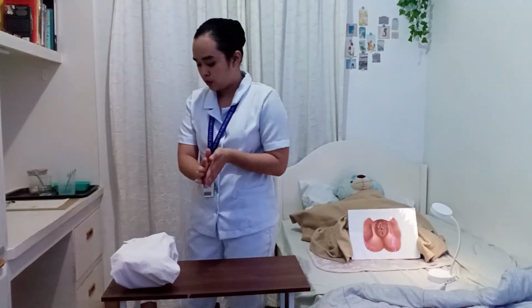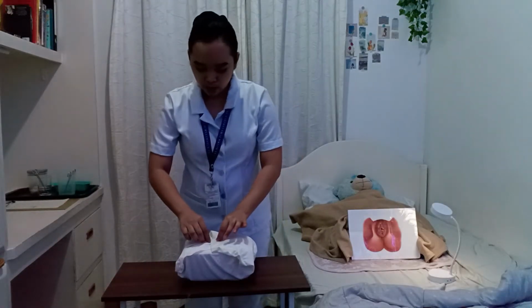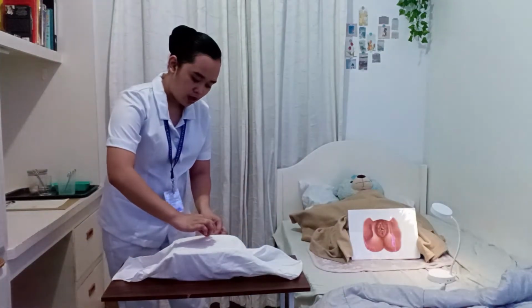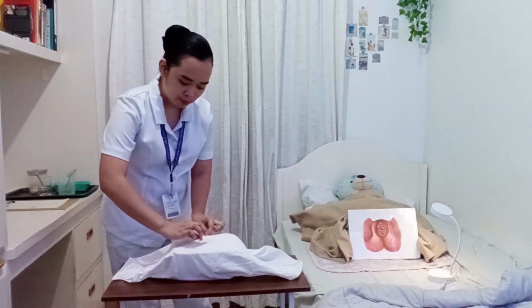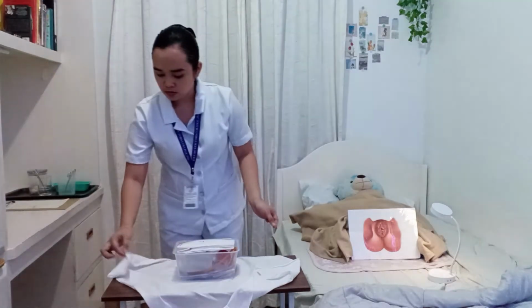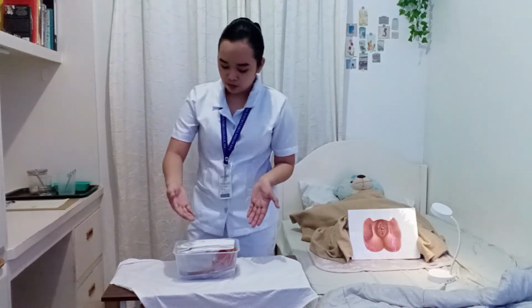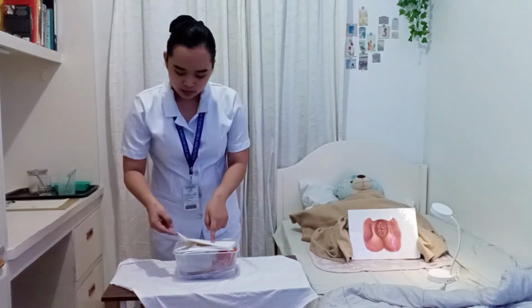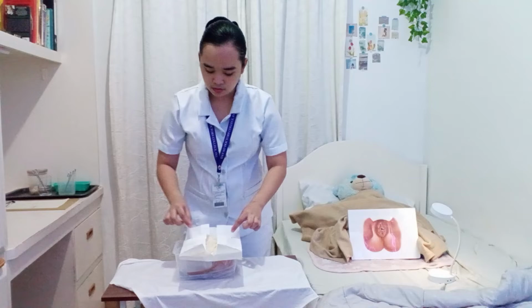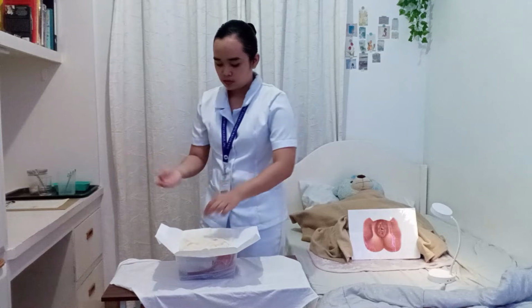Okay. And now we're going to open the catheter set. So always remember that this is sterile, so we're going to be careful in this part. So we're going to touch only the outside surface of the cloth, which is the wrapper. Okay, and now I'm going to wear the gloves that is included in this set. Okay.